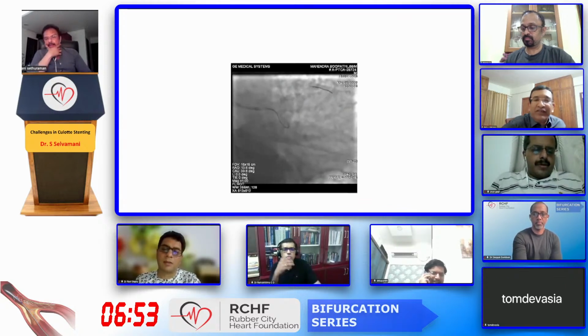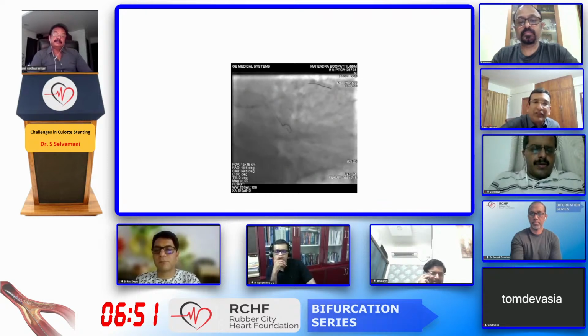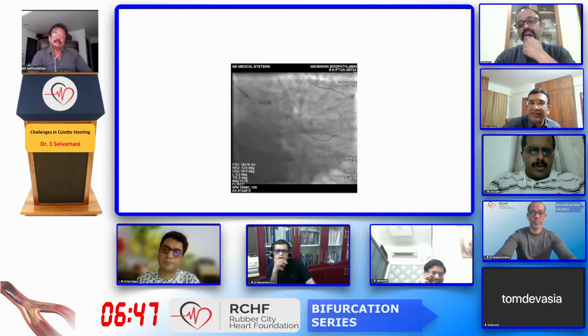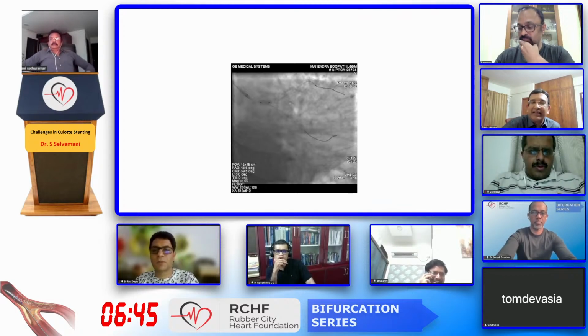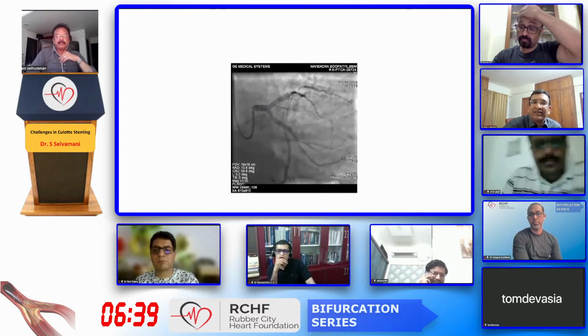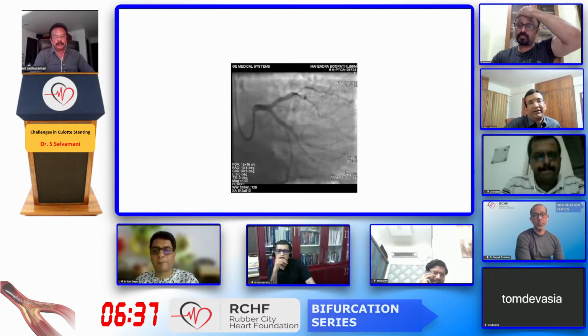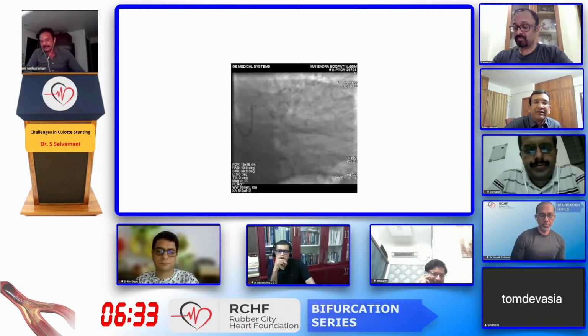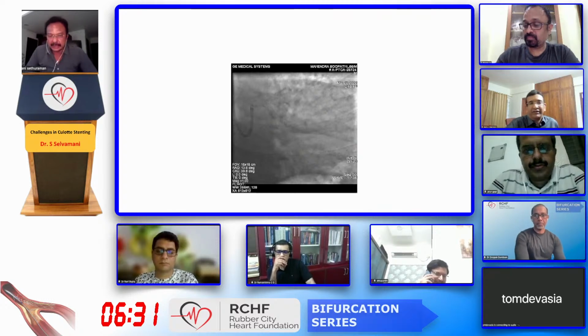Right. So, in the first case, when you stent from the circ to the left main, was the size discrepancy a concern for the stent, overexpansion of the stent? Yeah, of course, the circumflex was not so small, so we could expand the left main up to 4. So that was not a big issue, because we put a 3.5 stent in the circ and then expanded.